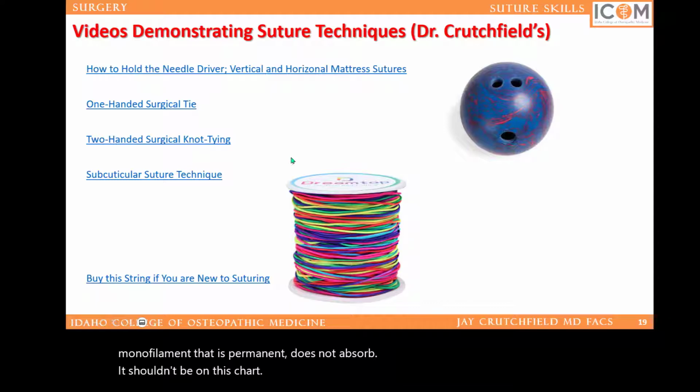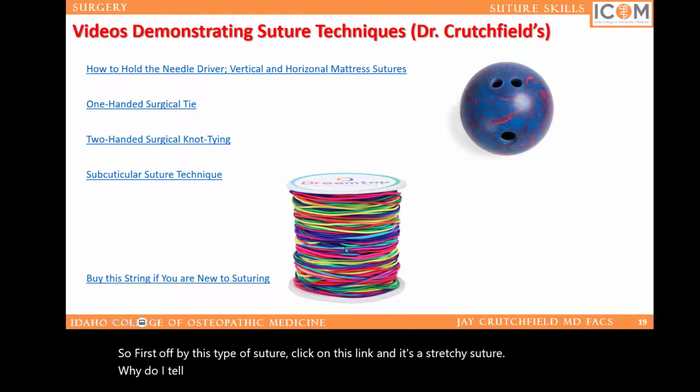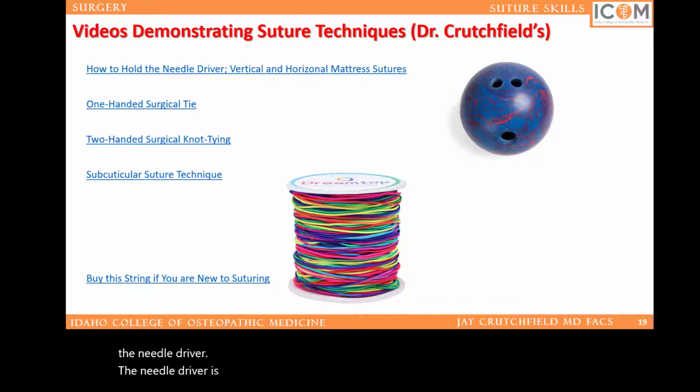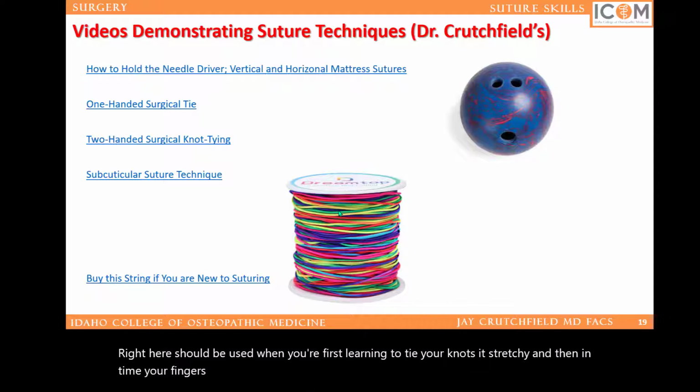So first off, buy this type of suture. Click on this link, and it's a stretchy suture. Why do I tell you to use stretchy suture? Because it stretches when your fingers don't. All right. So the bowling ball is here to remind me to tell you, do not put your fingers into the holes of the needle driver. The needle driver is not a bowling ball. This type of string right here should be used when you're first learning to tie your knots. It's stretchy, and then in time your fingers will learn, and the stretch string is no longer needed. But for now, it's really good to learn with and good for me to teach you with.